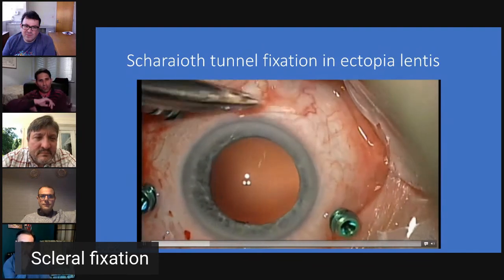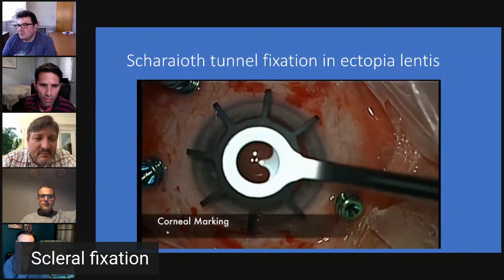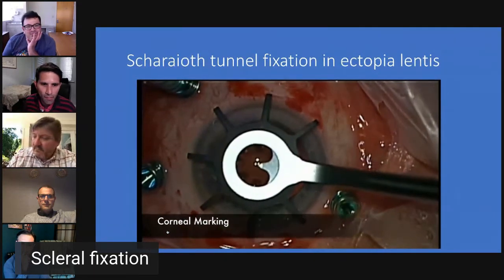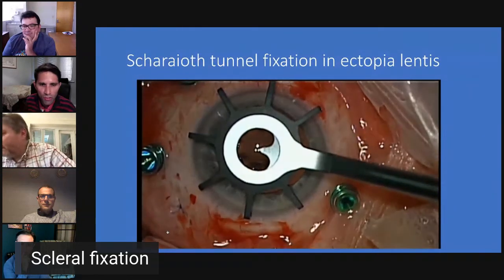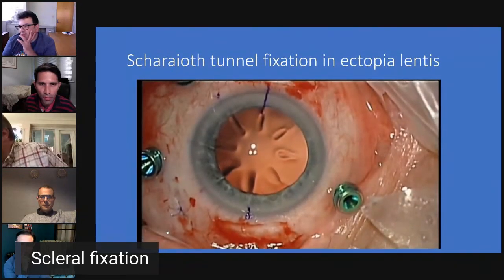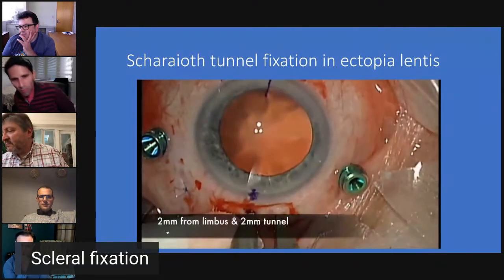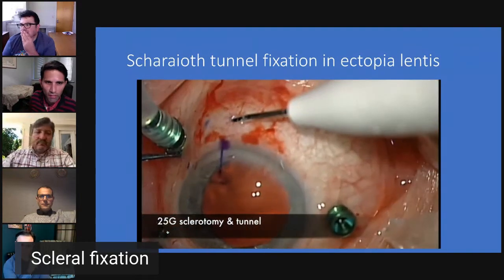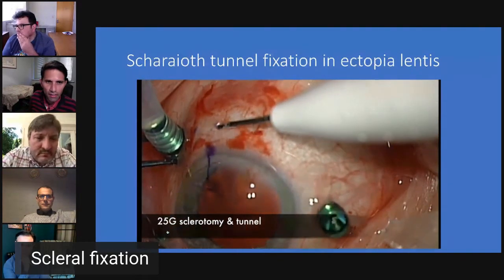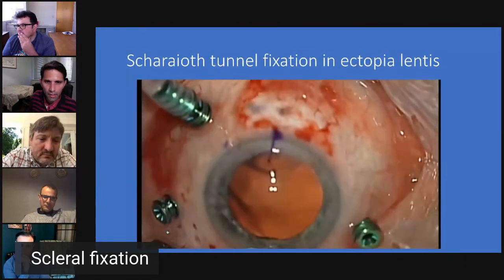So opening up the conjunctiva, I think it's nice to see what you're doing on the sclera. Personally, I make corneal marks so that you reduce the risk of putting the haptics not exactly perpendicular. This is a couple of millimeters, as opposed to 2.5 millimeters from the limbus, and a couple of tunnels, and then a 25 gauge blade to make sclerotomies, and then tunnels.